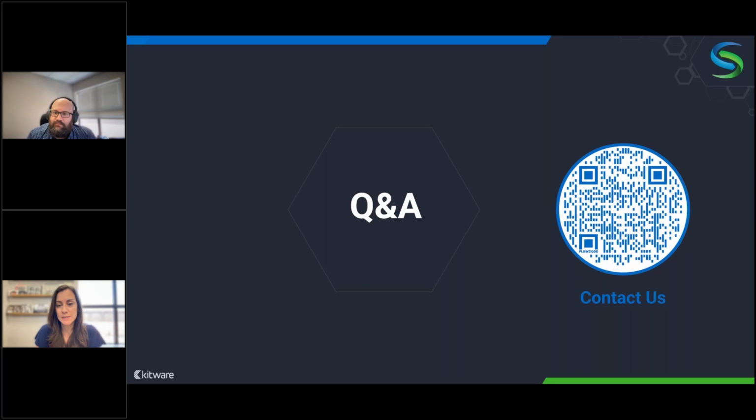The question is, does SlicerSALT work better in a specific operating system? We have made an effort to make SlicerSALT cross-platform. But macOS doesn't include CUDA support, so the deep learning modules are not going to work there. I think one of the deep learning modules will fall back to PyTorch CPU support if you don't have a GPU, so it can run on the CPU, but there is one of them that requires a CUDA GPU.